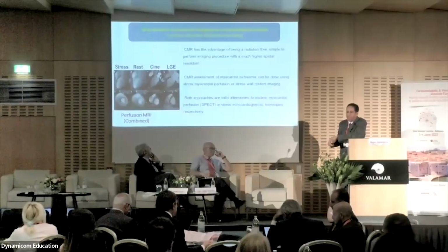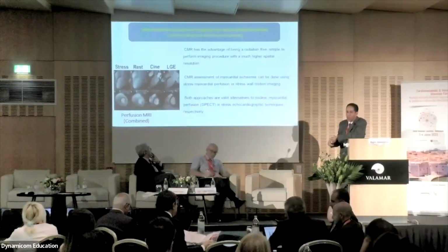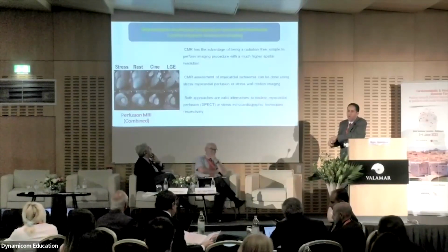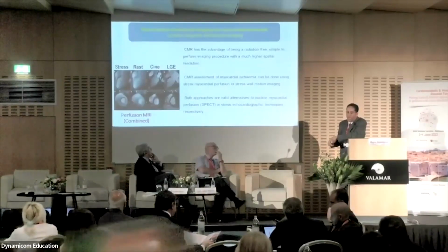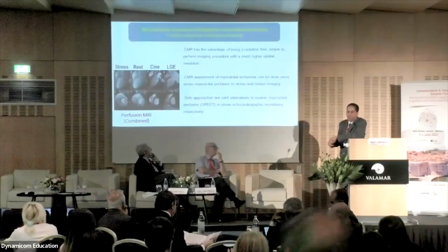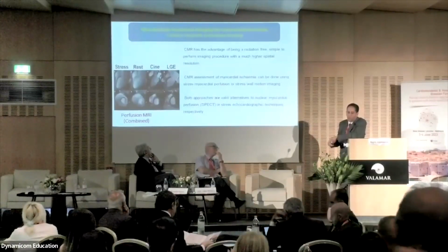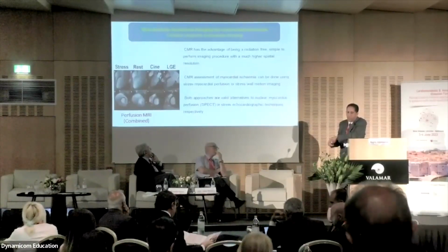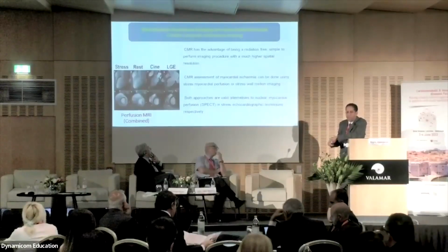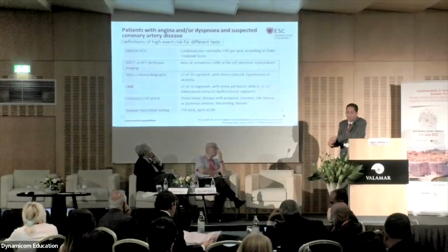Recently, cardiac magnetic resonance imaging has a role also in diagnosis of coronary artery disease in patients who are unable to perform echocardiography, and it can also assess the LV volumes, the ejection fraction, and the presence or absence of myocardial ischemia. So it's considered a complementary non-invasive imaging test for coronary artery disease patients. If we did all these investigations, so who are the highest risk patients?